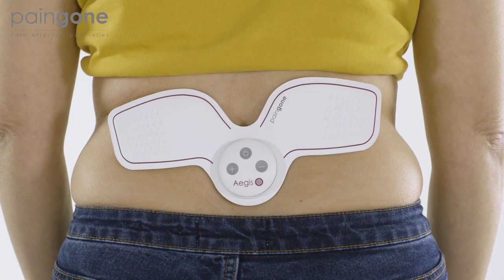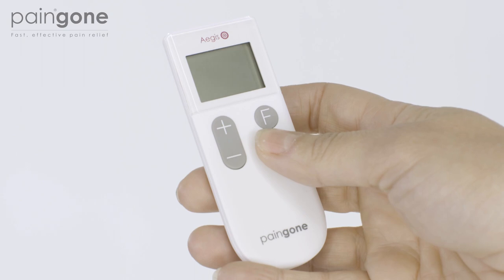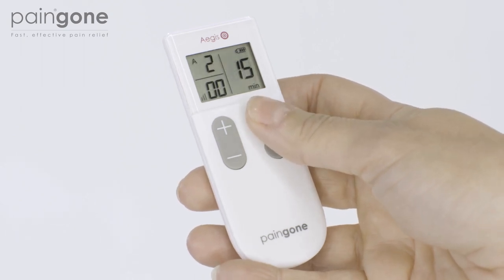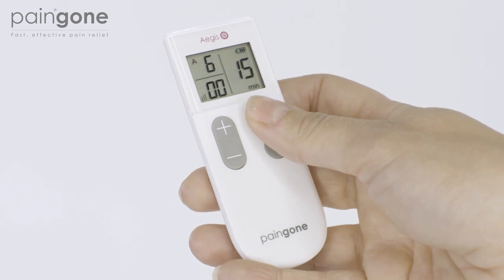Aegis will now deliver stimulating and soothing pulses that help relieve and reduce pain. Pressing the F button on the remote control will cycle through different combinations of pulses. There are 6 combinations of pulses available. Experiment to find your preference.